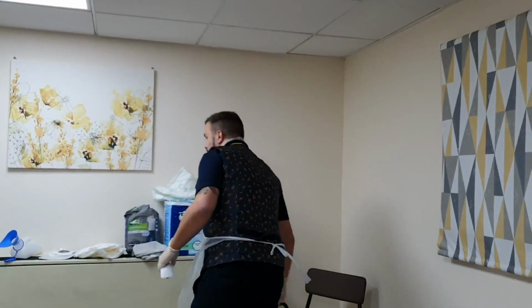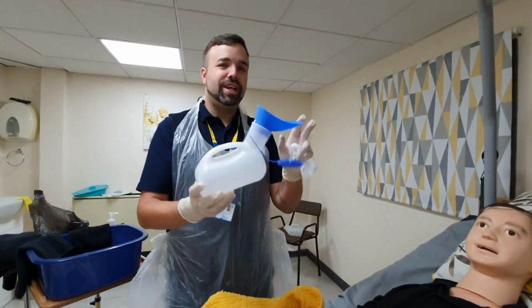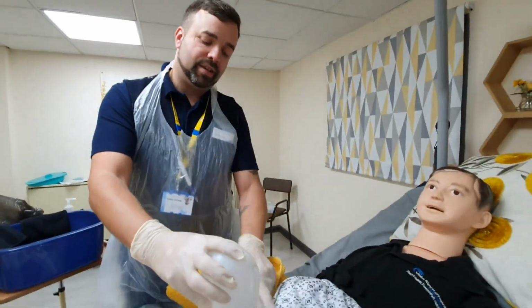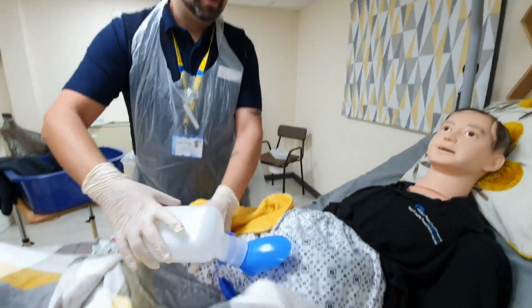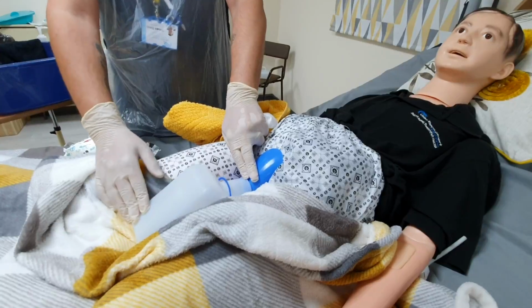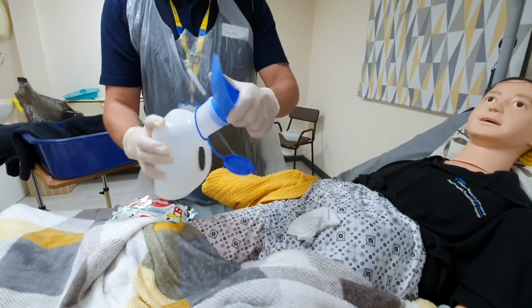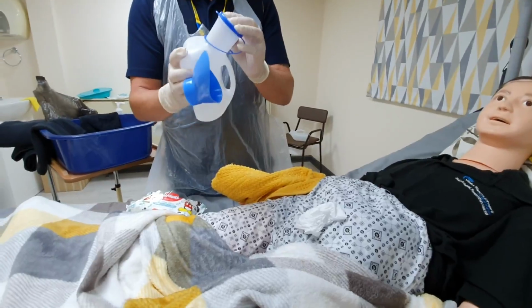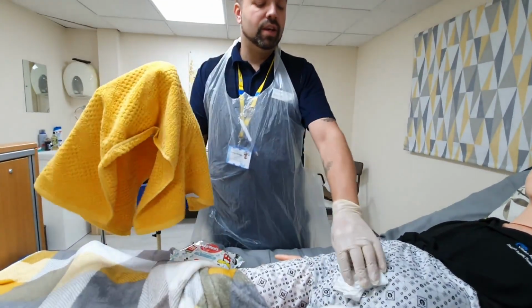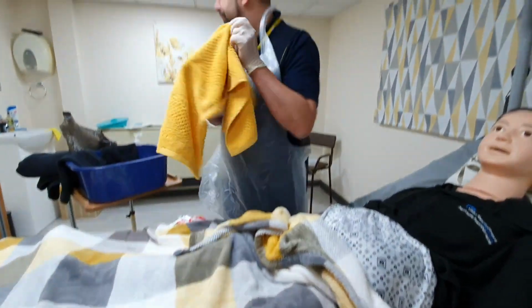Now, let's assume George is Georgina and we need to use the female bottle. So again, same principle, but we would place the bottle over here. She would be able to use that and then fill it up. Again, we would take it away, we would wipe, we take the funnel off, we pop the lid on and we remove that. And again, good personal hygiene for urination.